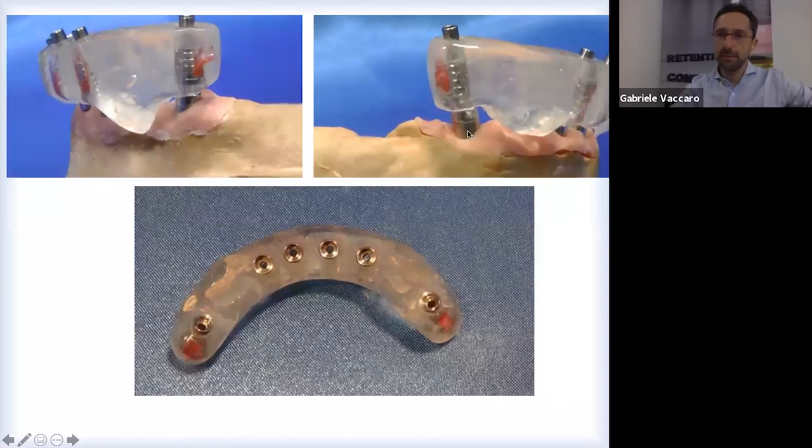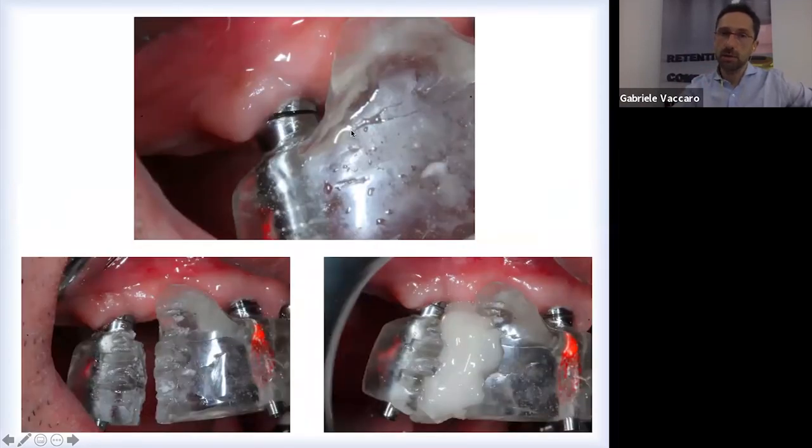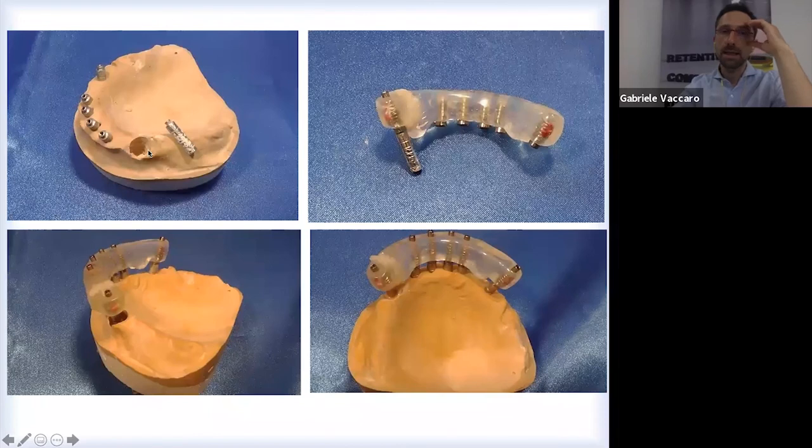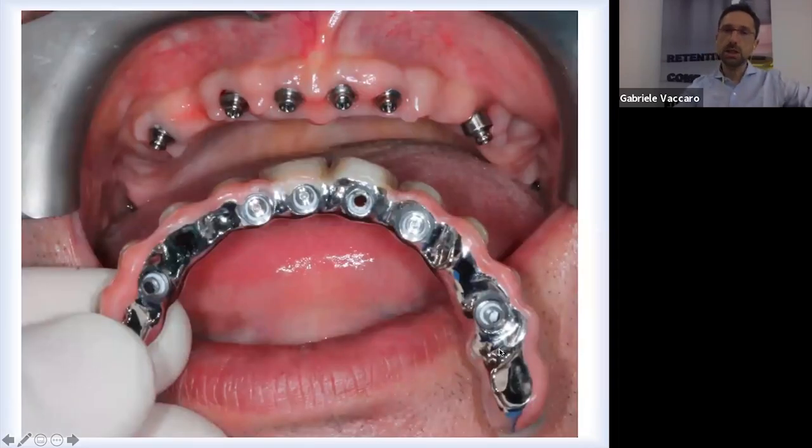After that, I check with a jig. I want to be sure that there is a perfect match between my impression and my model and the mount. And I see that in the last implant, I have a gap. Maybe, as I said, because I tightened the dental floss too much, or the resin shrank and pushed the transfer, tilting it. So I had to cut it and then glue it in again and give it to the lab. And the lab just made a hole, extracted the analog and put the analog inside the new jig, in the new position, and then put some cast down here, and registered the new position for the analog. After that, the technician gives me the framework.